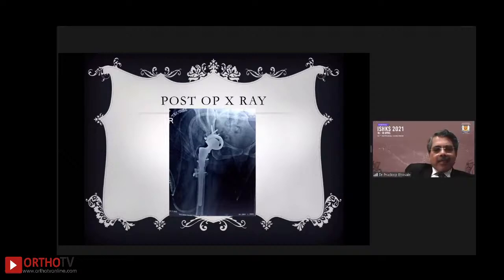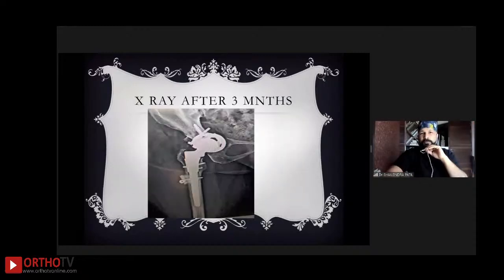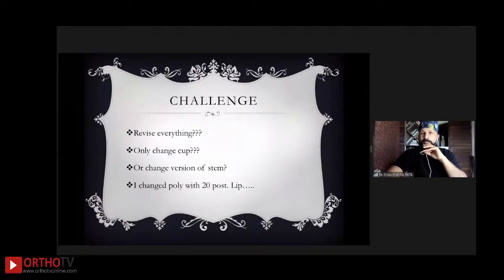And version, everything on the intraop. This is now 3 months post-op. Patient is doing well, walking on it, but still he is using one stick and a walker. He was put on complete bed rest for one, one and a half months, and put on TP, teriparatide again, and all other.